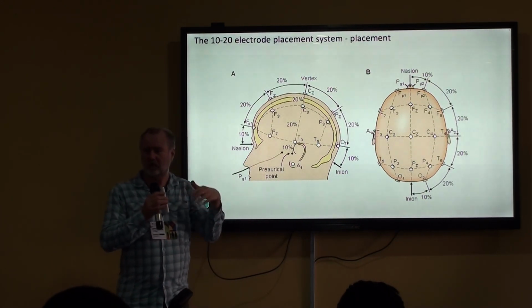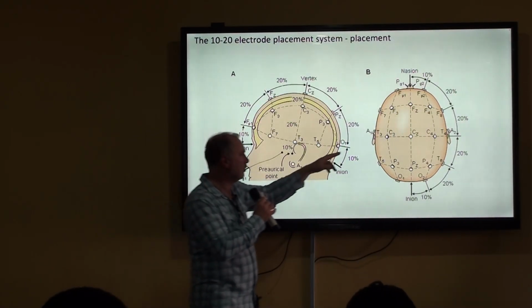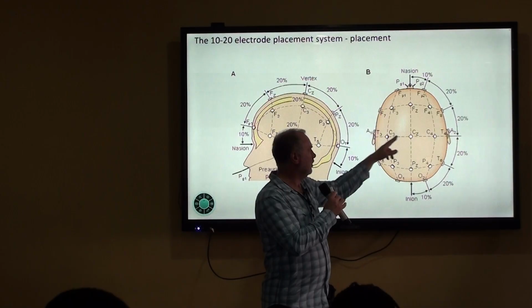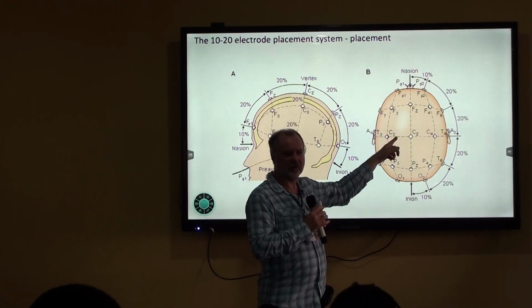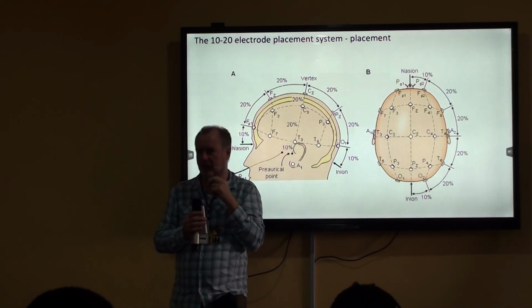And then we basically start by partitioning this into finer steps where we use 20% distances. So C3 is 20% of this distance. And you can already imagine that you can also place C1. C1 would be in between at 10% distance. Is this clear?